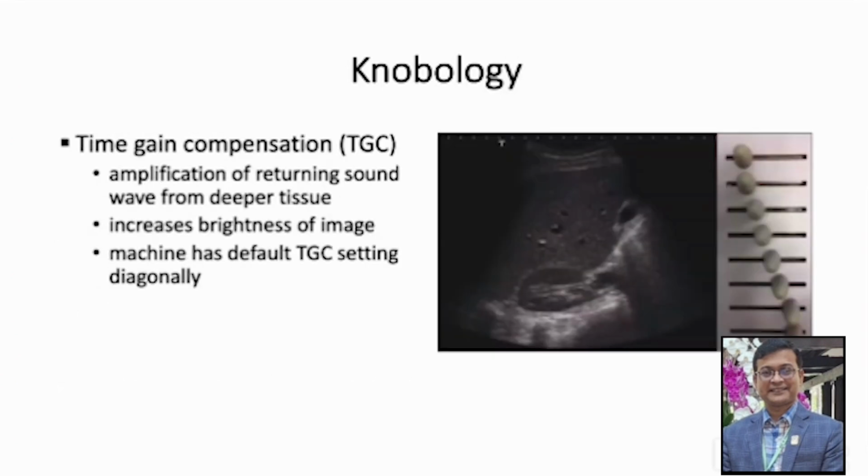And the next one is the TGC or time gain compensation. What is this? Just think, when the sound waves propagate forwards, the nearer structure is reflected first and then the furthest structure. So certainly the image that we get from the nearer structures is brighter than from the furthest structure. As a result, the furthest structure is blurred. So the machine has an option for amplification of the image of the furthest structures. This particular property is called the time gain compensation or TGC.